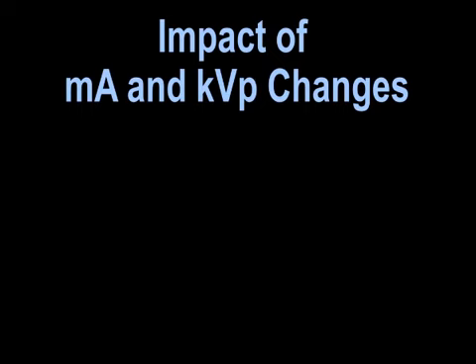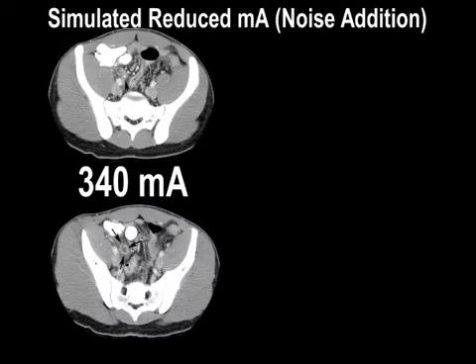I'm going to talk just a little bit about some of these major things that we can modify before I get into special technologies. Tube current and kilovoltage, as you've heard, are two fundamental things. They're like cameras. For those of you who know, we used to have to adjust cameras with f-stop and shutter speed. Does that sound familiar to some people? It was kind of nice, but so much easier now. This is sort of our shutter speed and f-stop now. These are the things that we can adjust quite easily, and I'll get to those other technologies. But let's just look at these.